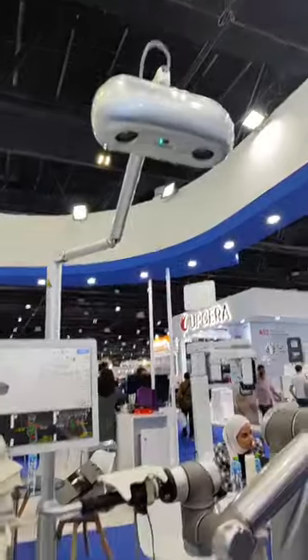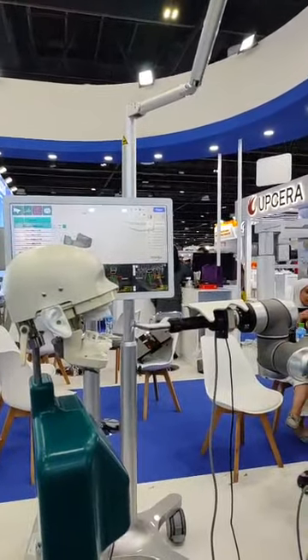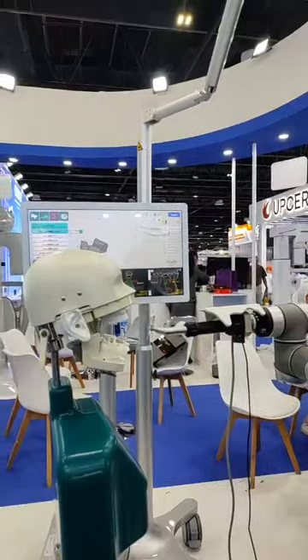Can you explain about the parts of your robot? Of course. Before the surgery, we take CBCT and oral scan of the patient, put it into our software. The surgeon will decide where the implant should go, and all the data are transferred to the robot. During surgery, the robot uses the camera to check the movement of the jaw and the handpiece, and it will align the drill bit to the implant precisely.